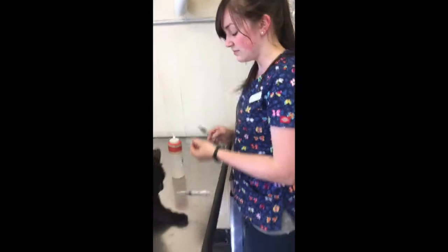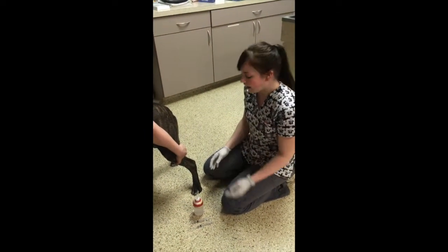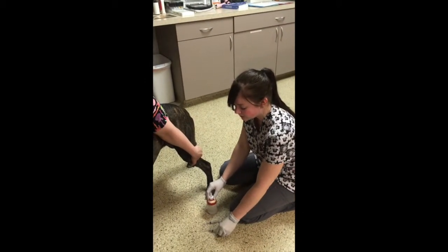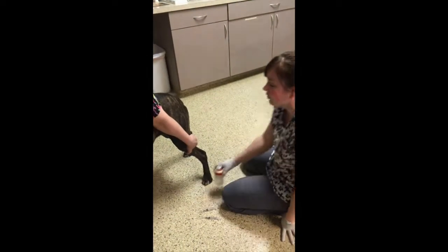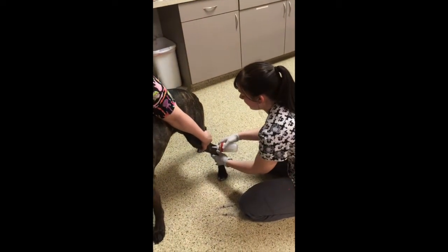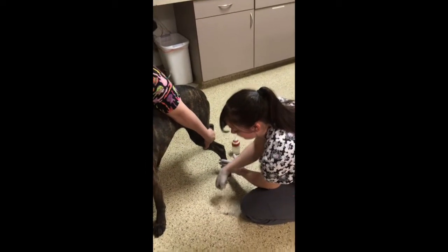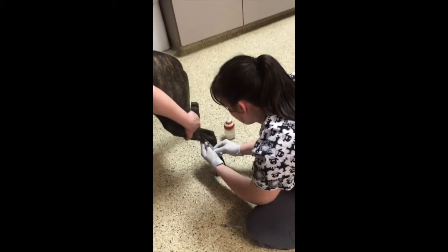This is Ellie. We're going to be drawing blood from Ellie using her saphenous vein. I have everything that I need. I have my 3cc syringes with a 22 gauge needle, my alcohol, and I'm wearing my exam gloves. My assistant is holding out pressure on the vein. So I'm going to go ahead and apply alcohol to the area, grab my syringe, remove the cap, making sure that bevel is up. I'm going to go ahead and insert my needle.